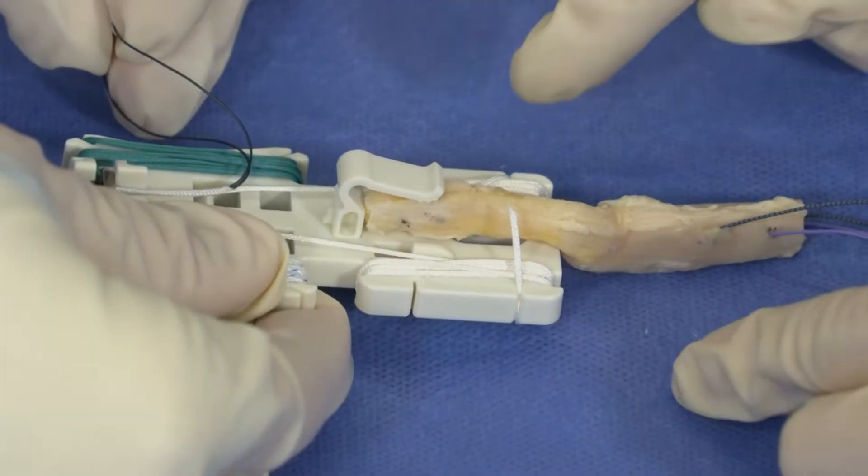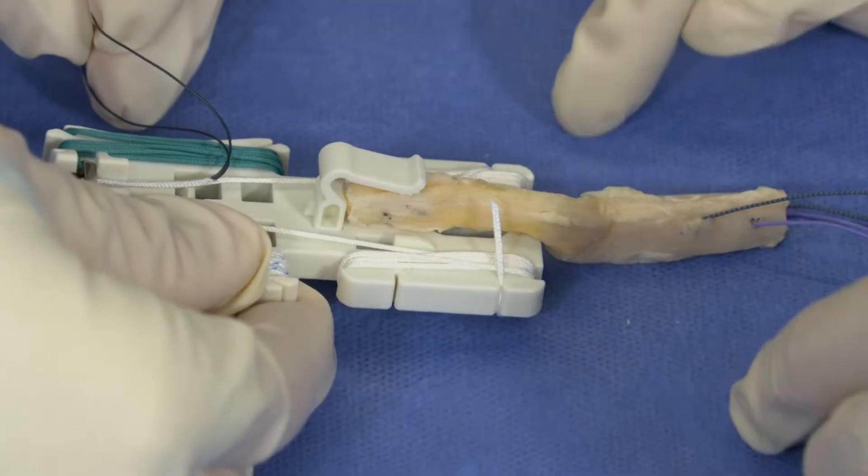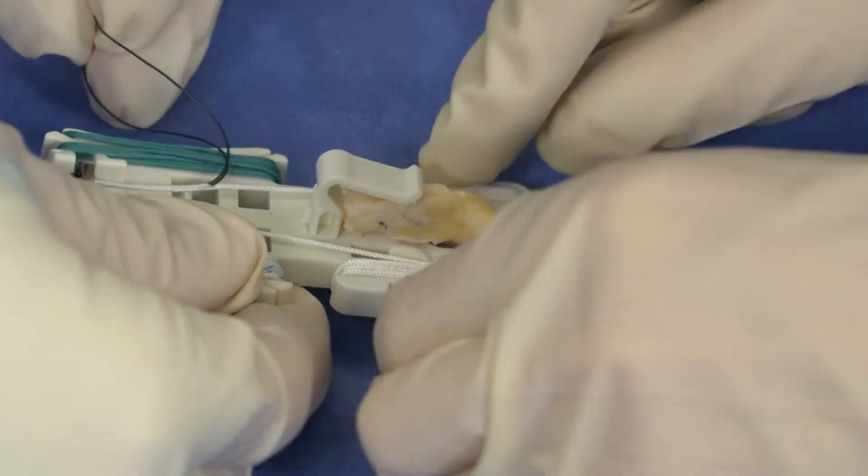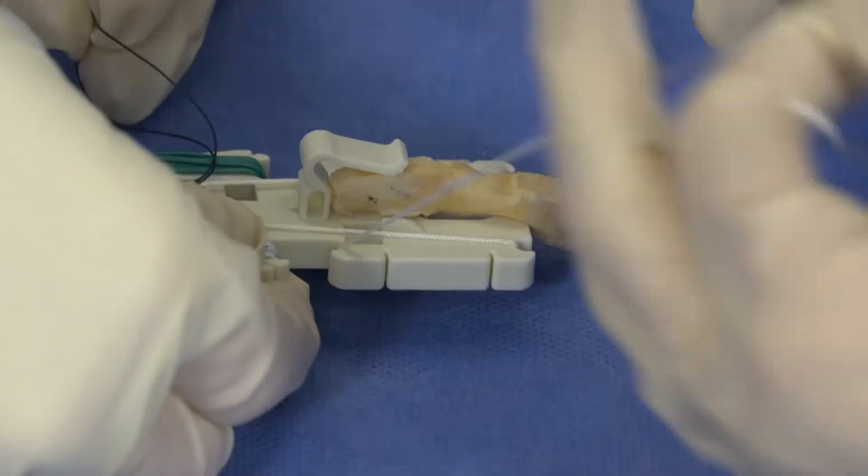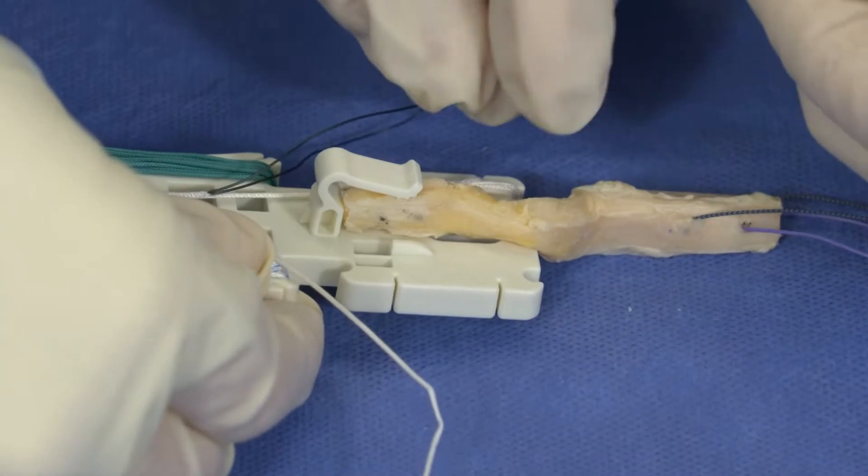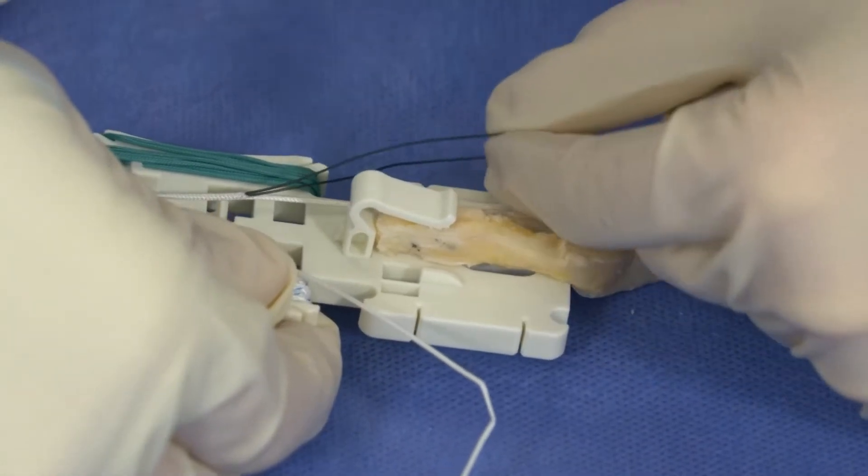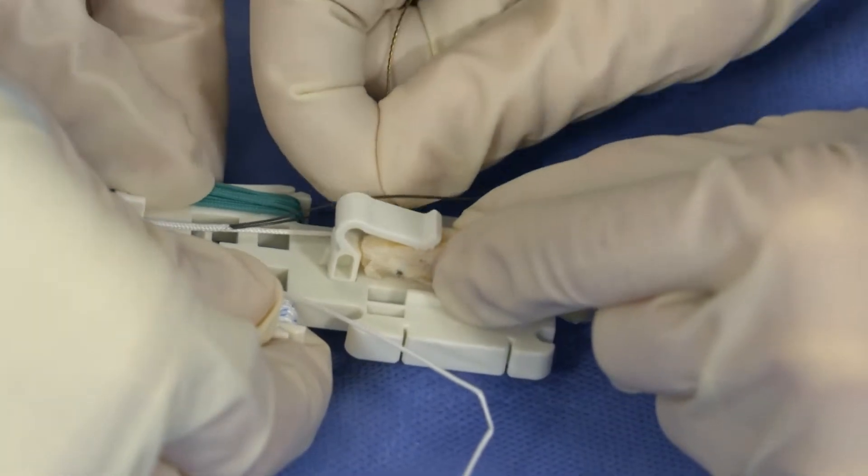I'm now going to be focusing on the tensioning suture going through the proximal hole of the graft. It doesn't matter which side you go through. Here I'm unraveling the first tensioning suture and I'll be taking a chia passer going through the opposite black relay loop through the proximal hole of that graft.